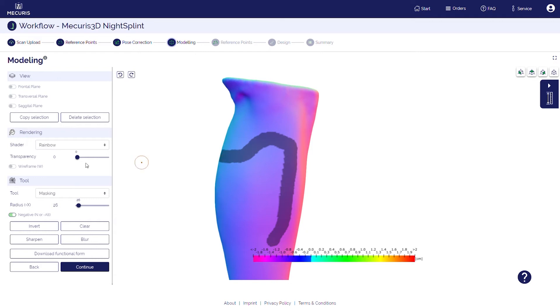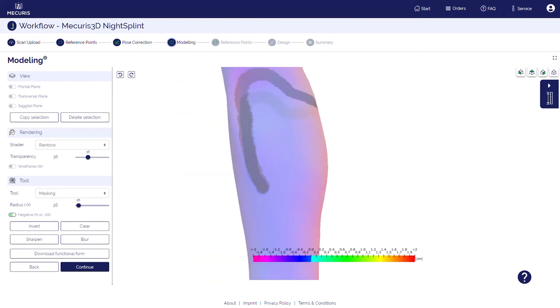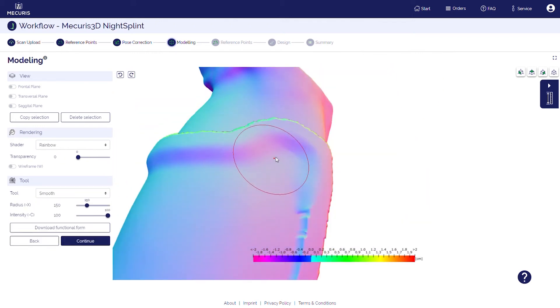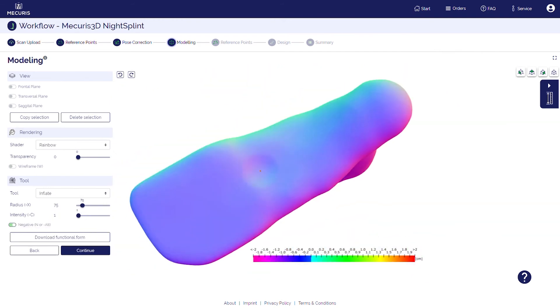The best thing is, you're not limited to lower extremities applications. You want to create a functional form for an orthosis for the upper extremities, the trunk, or even the head? No problem — the Mercurius 3D modeling tool makes it possible.